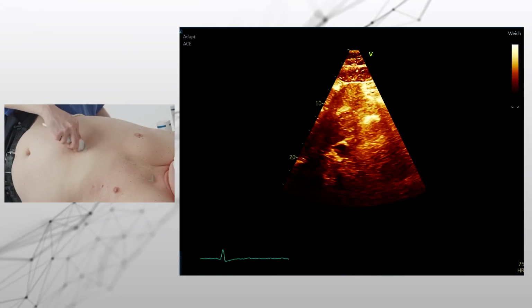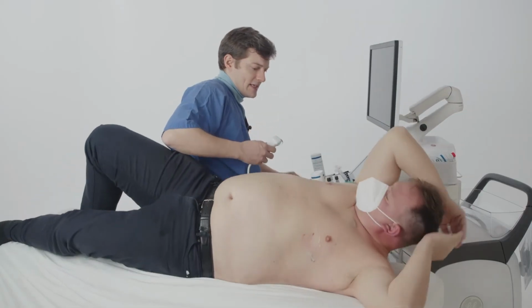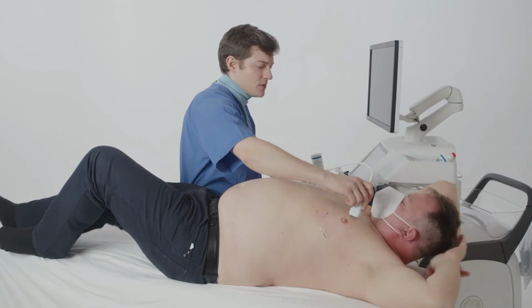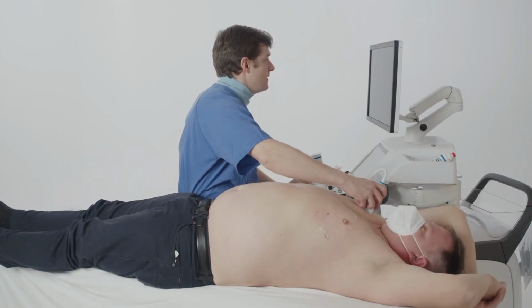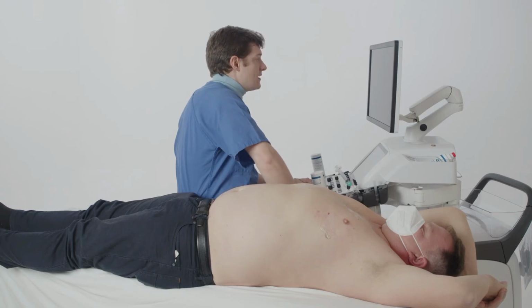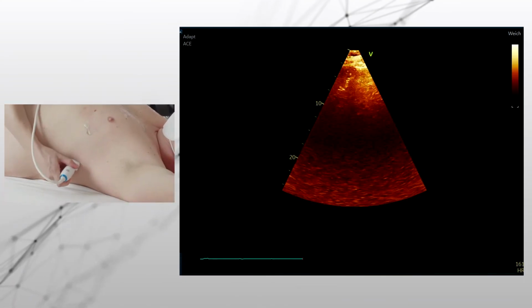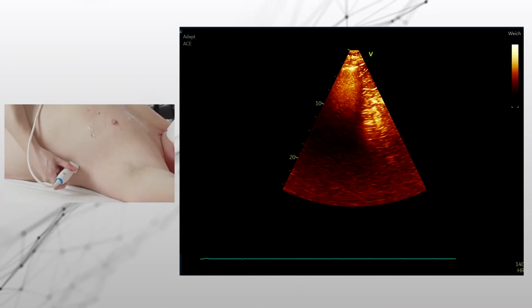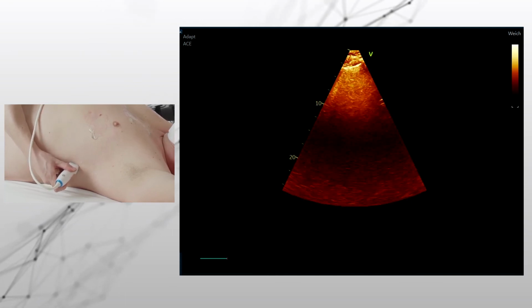Then the last thing we need to do, kannst du am Rücken legen bitte, is scan the lungs. So what we normally do is we scan from anteriorly. We can also use a linear transducer if we have it, or we can simply use this transducer to see artifacts. We do not have any, and then we continue with pleural effusion, which we also do not have. So we would look here for the pleural effusion, left and right side.